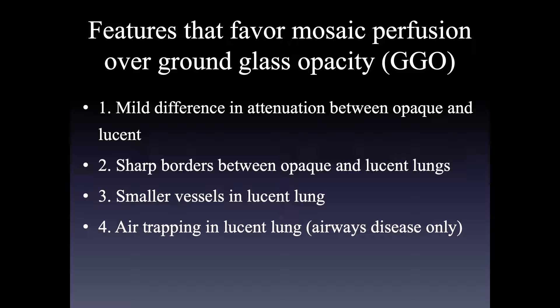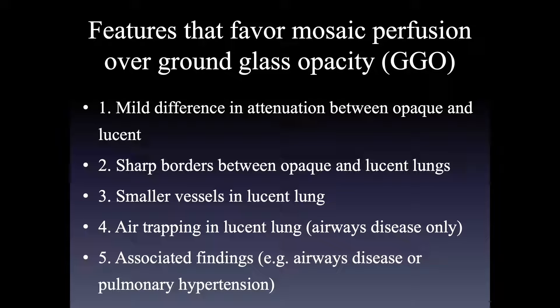When mosaic perfusion is due to airways disease, you would expect to see air trapping on expiratory CT in the same places that are lucent on the inspiratory CT. Associated findings can also be very helpful: we can see findings of airways disease such as tree-in-bud opacities, centrilobular nodules, or airway thickening, or signs of pulmonary vascular disease — particularly pulmonary hypertension — such as a big pulmonary artery or big right ventricle.